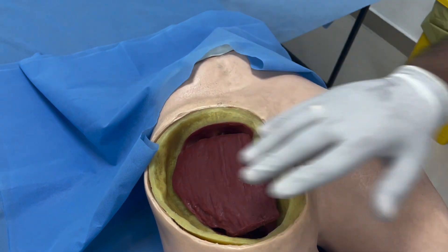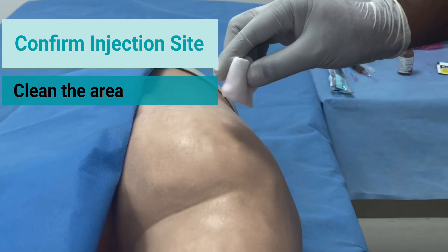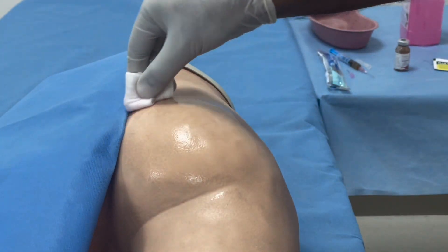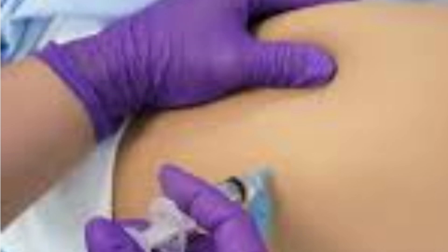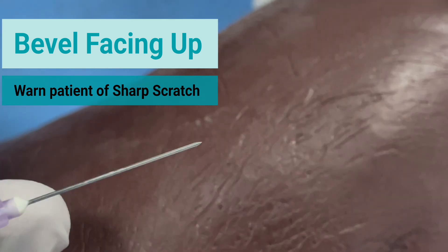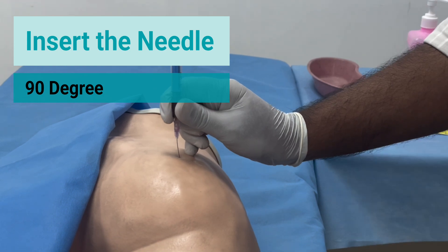Confirm the position once again and clean the area using an alcohol swab. Traction needs to be given using a non-dominant hand. The syringe bevel needs to be facing up. Always warn the patient of a sharp scratch before administering the injection. Hold the needle like a dart and insert it at a 90-degree angle.